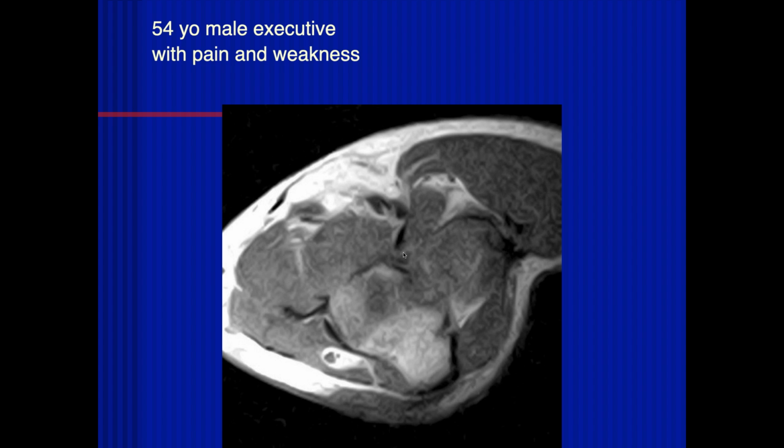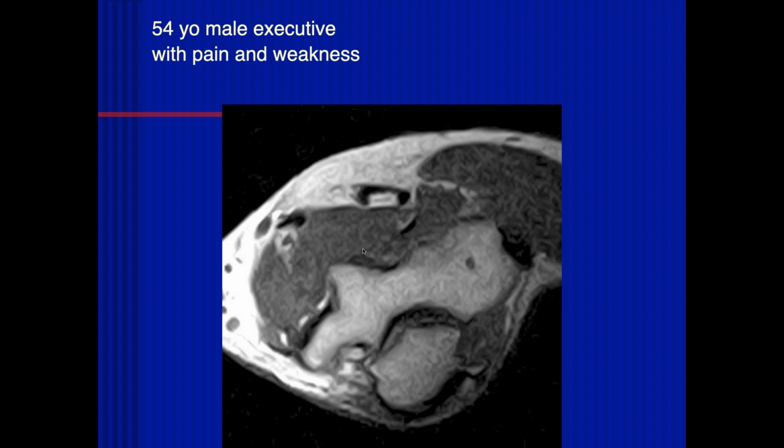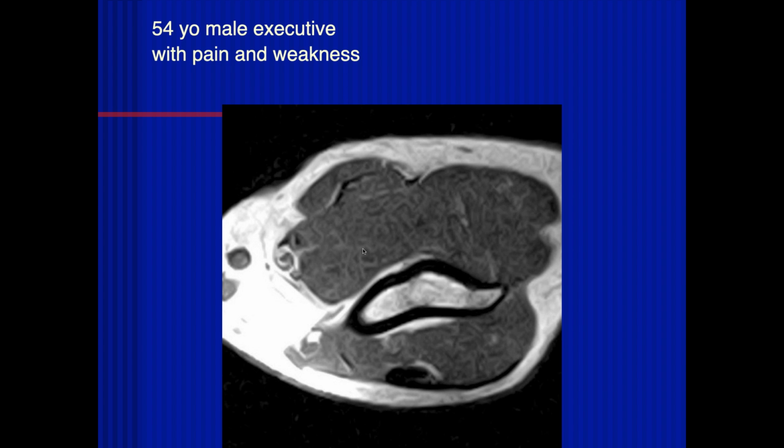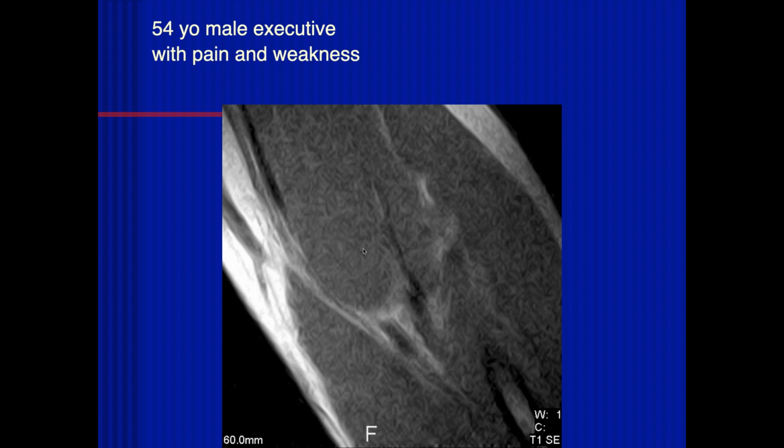So John just called, and I guess his system went out. So go ahead, Michael. This is a little bit more proximal. What are we seeing here? It still looks abnormal here with intrasubstance signal. There it's almost like a longitudinal split. And there it looks fairly normal up in the muscle.